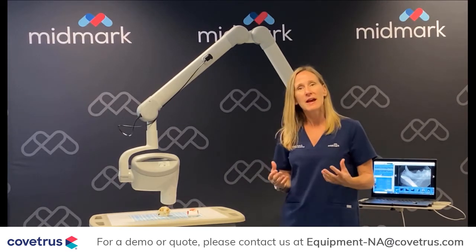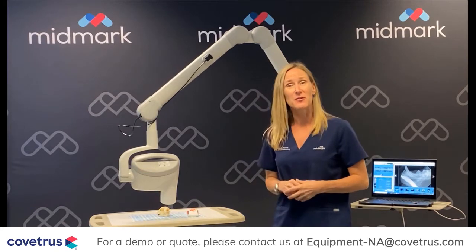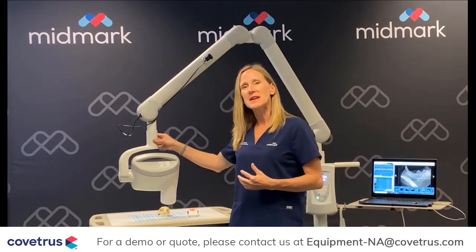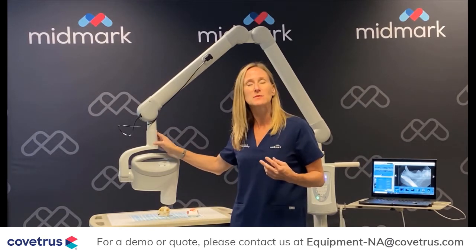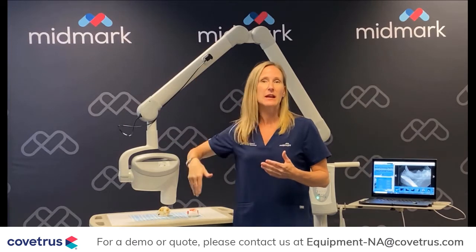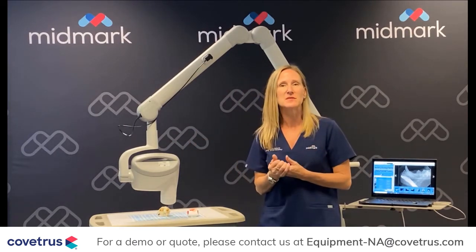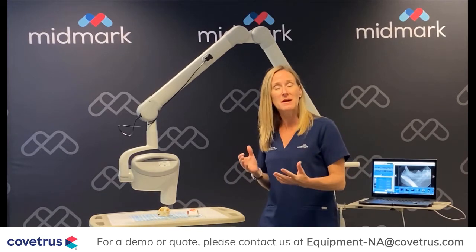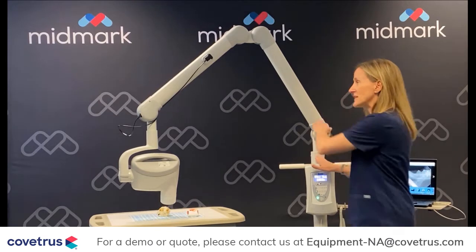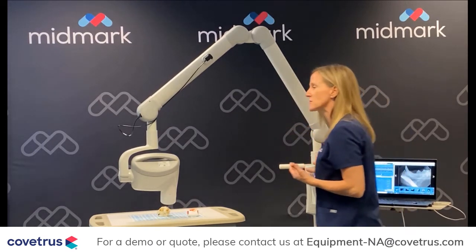Number one, you need to have a stable arm. That's what we're known for with this generator — our arm stability. The reason our arm is so stable is we have proprietary braking mechanisms which prevent horizontal drift and the articulating arm from drifting up and down. We've got two braking mechanisms in the wall-mounted system and one in the mobile generator, which prevents the articulating arm from drifting. This is what's made our arm the most stable in the industry.